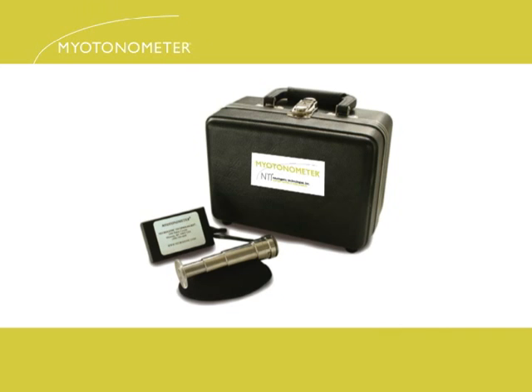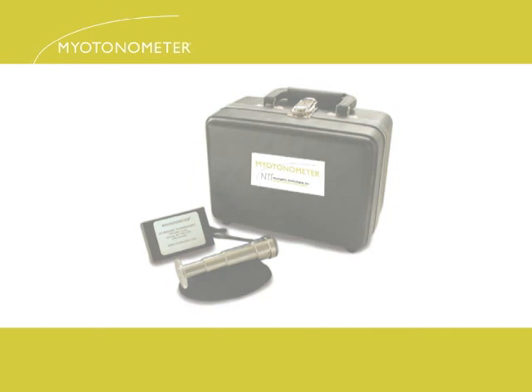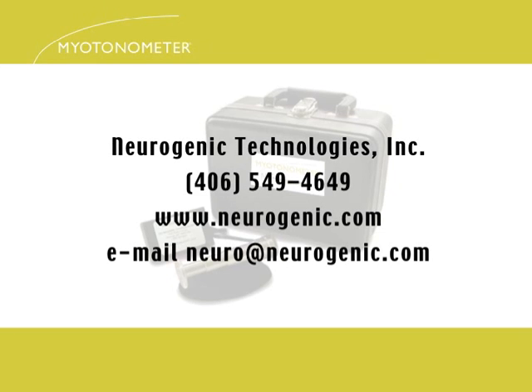Published studies have shown that the myotonometer is a valid and reliable instrument to assess the neurological patient. Please contact Neurogenic Technologies for publication references.